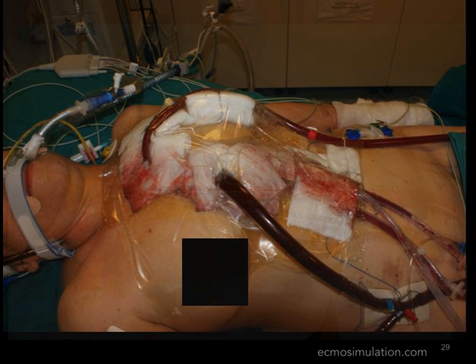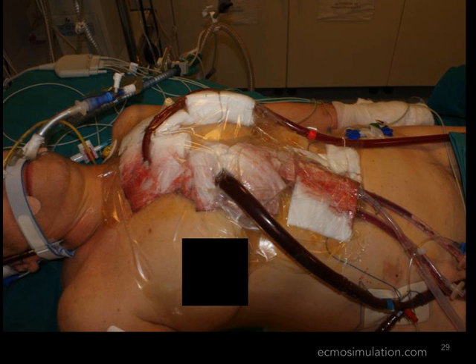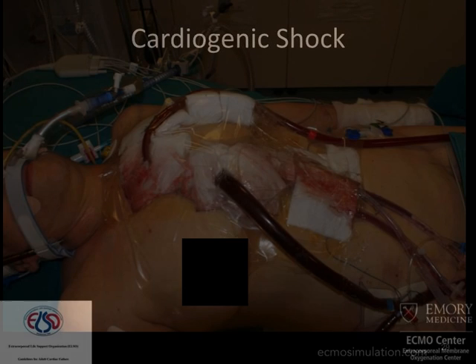Post-cardiotomy, you can use this if a patient has failure to wean from bypass. This doesn't look nearly as pretty. And what you wind up with is essentially drainage of blood and return of blood using the circuit. These patients tend not to do as well. So post-cardiotomy ECMO patients have very high mortality associated with them, but it is something that can be used to get out of the operating room and offer patients the ability to hopefully recover.